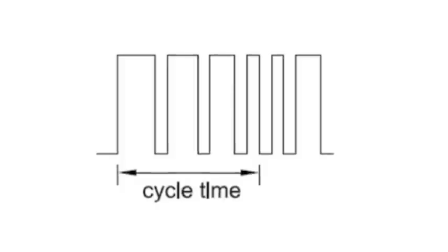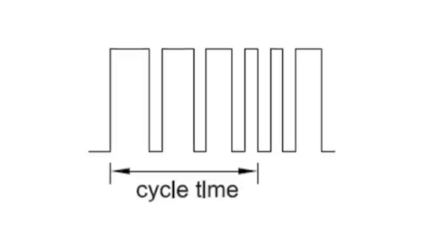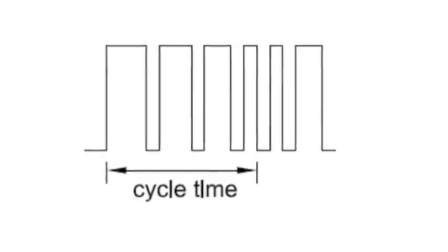In the modulation mode, what happens is the pulse width will vary from a short pulse width to a longer pulse width, to a short pulse width and a longer pulse width. What that will do for you is to actually change the character of the electrical impulse.